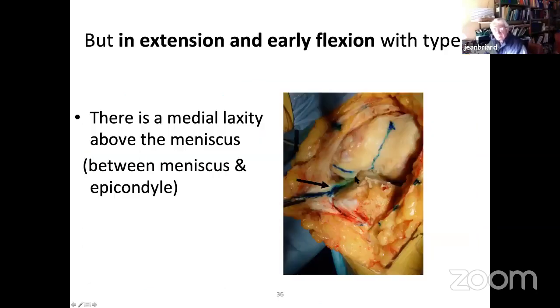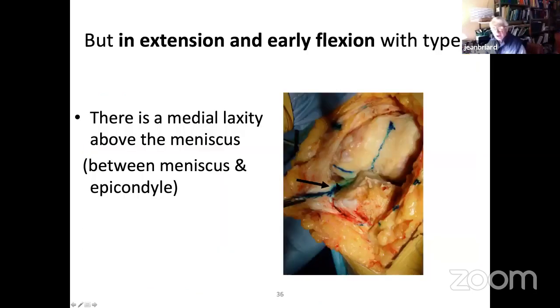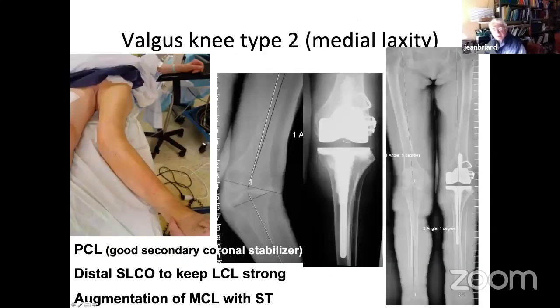So here, when I was in 90 degrees, I try to push, I can't open. I go near to extension, and it opens up. So you have laxity between the epicondyle and the meniscus. This was addressed first by Healy, by a bone plug recession of the epicondyle. And when it's not too much of a medial laxity, I think that's a good technique.